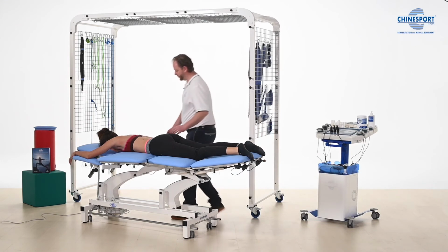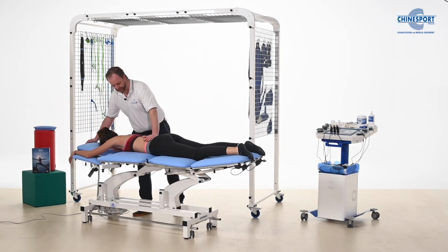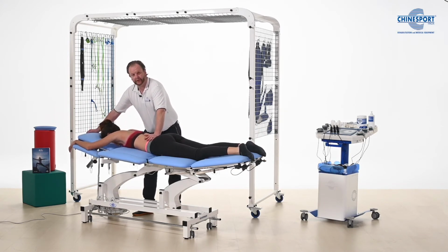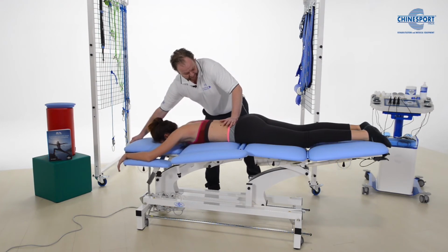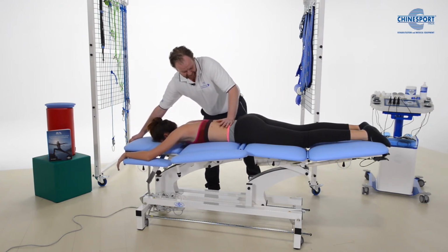We want to use the McKenzie principles. We can go into extension by using the upper controls. We can go up and down into extension and even to flexion if we want. If we want to block some segments, we can do that with our hand here.